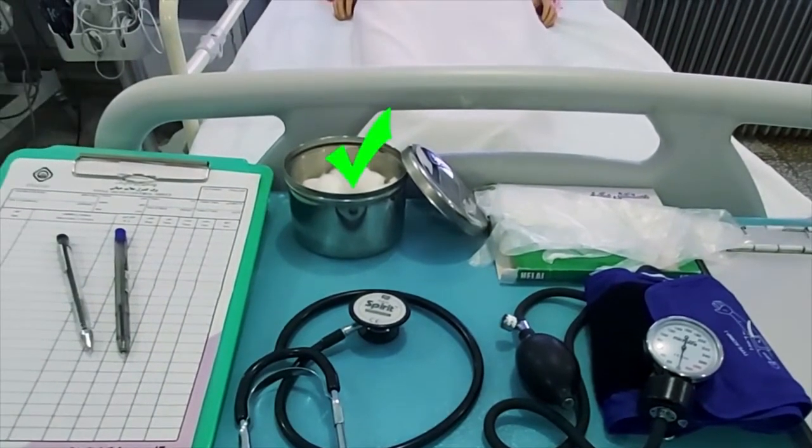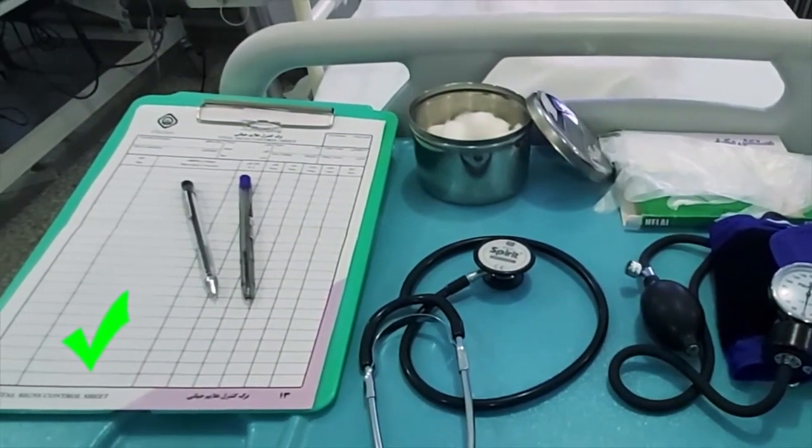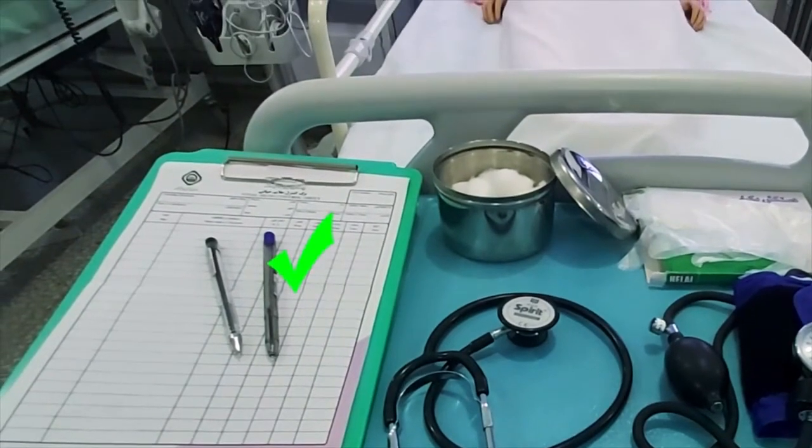برگ کنترول علایم حیاتی را آماده می‌کنیم. خودکار آبی و خودکار مشکی نیز آماده می‌شود.